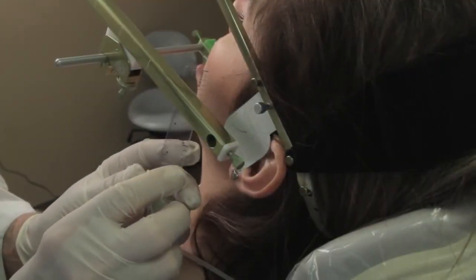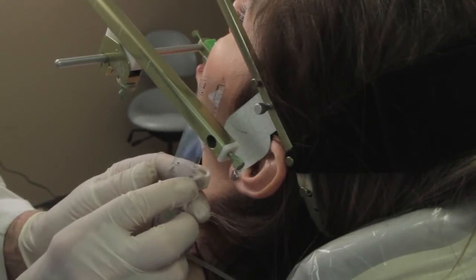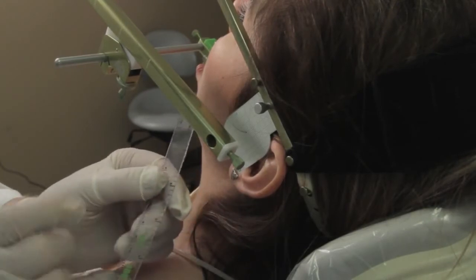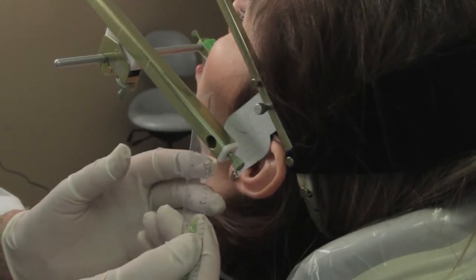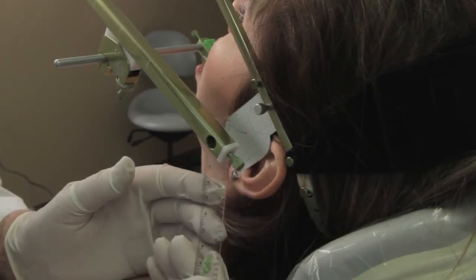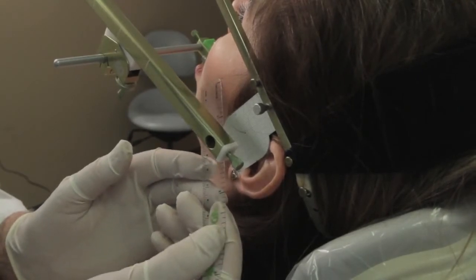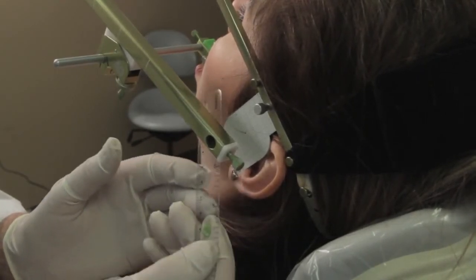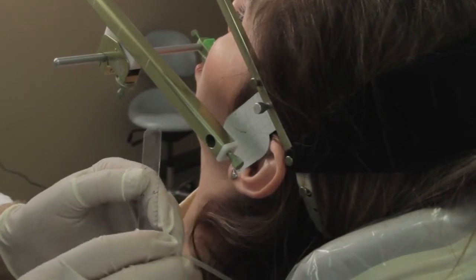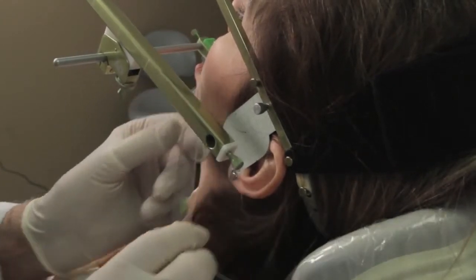We're going to line up the mark here that we made when we did the estimated face bow, which is in the same plane as the orbitale that we marked up by the nose. So we're going to mark orbitale. This is the height of orbitale, and we're going to line it up with the hinge axis point here, and we're going to draw a line across the flag. That is the axis orbital plane. So we're establishing the axis orbital plane on the flag. So I have to line the ruler up.